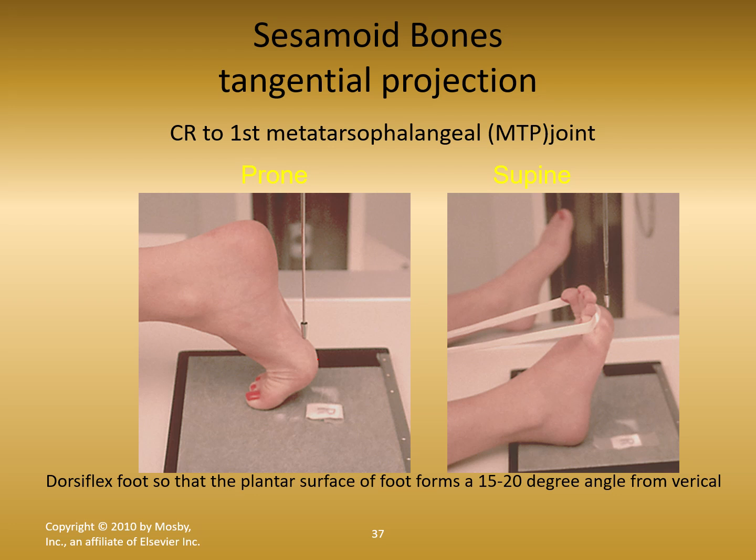So if your patient can lie prone and stretch their toes out like this, that's the best way to do the position. Notice they're very specific about the dorsiflexion of the foot. They say dorsiflex the foot so that the plantar surface of the foot forms a 15 to 20 degree angle from vertical. Vertical would be, if you watch, the center ray is perpendicular.